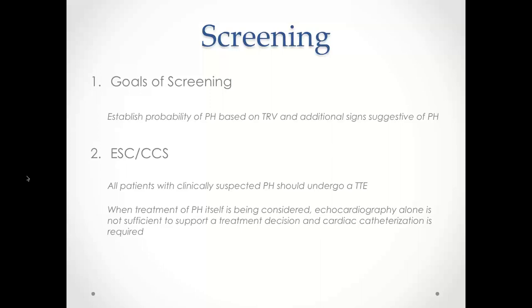The goals of screening by echocardiography are to establish the probability of pulmonary hypertension based on tricuspid regurgitation velocity as well as additional signs suggestive of PH. General recommendations are that all patients with clinically suspected PH should undergo a TTE. When treatment of PH is being considered, echo alone is not sufficient to support treatment decisions and right heart catheterization is required.